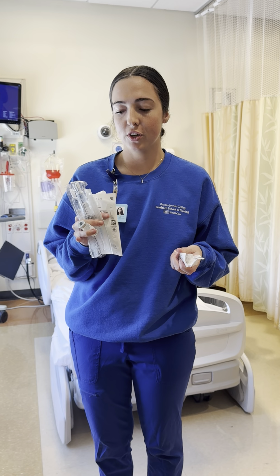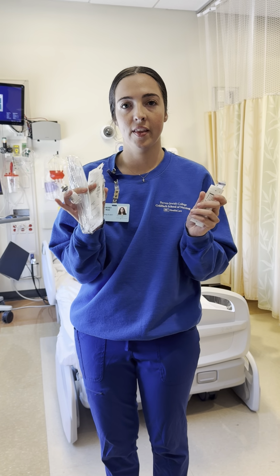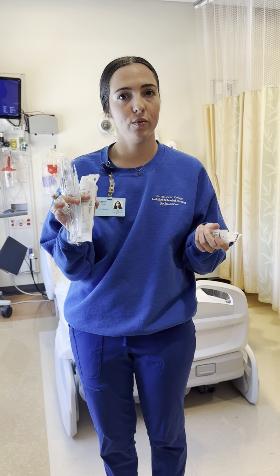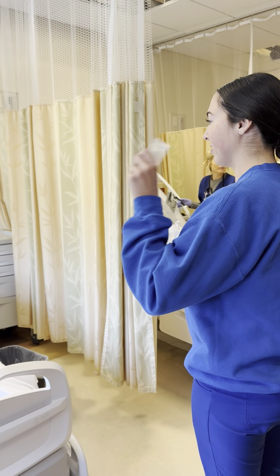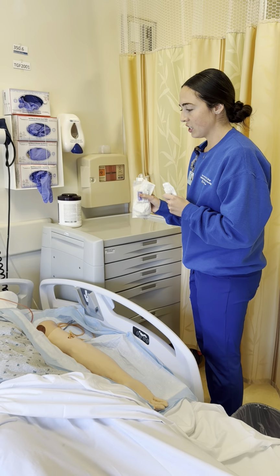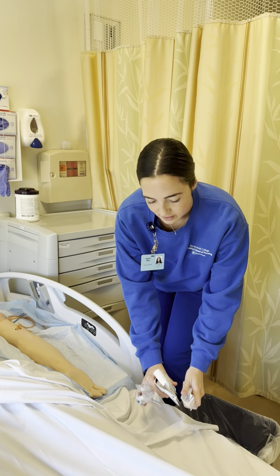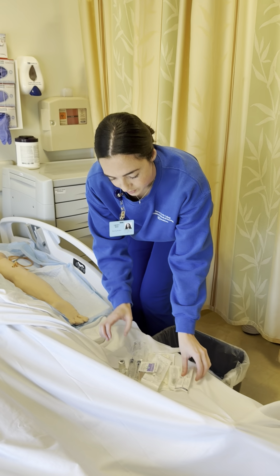So the first thing we're going to do is make sure that all of our items are not expired and that they're still in the correct packaging, and then we're going to go in the room. So first, knock, knock. Hello, my name's Lindsay. I'll be your student nurse for today. Is it okay if I place a few items on your bedside here? Okay. So I'm going to place all of my supplies on the bed.